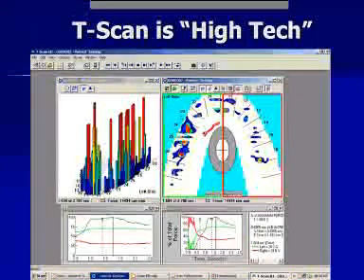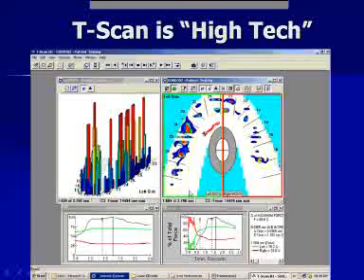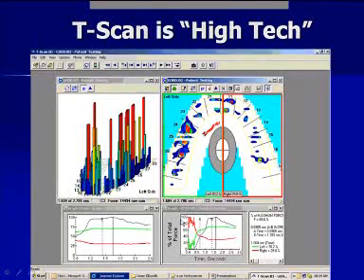But what you want to do is use the data as a means to instill the need about a situation. Now, one thing that you need to remember is that if you give the patients too much information, they get overwhelmed and they don't make any buying decision. So therefore, hone in on 1 or 2 areas and use that information.